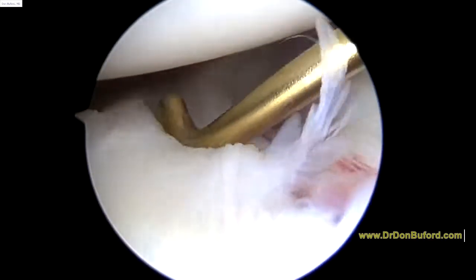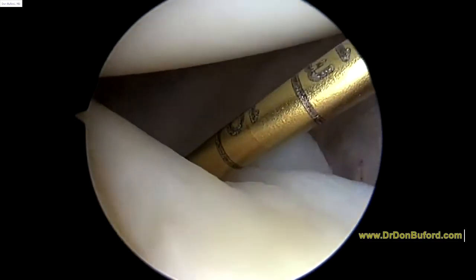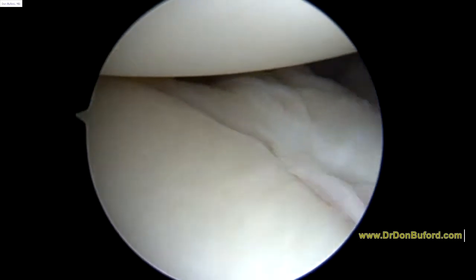Okay? This little thickening right here. And again, that probe is 1 millimeter. So that's it. This looks pretty good. We're going to get to work and look on the bursal side in just a minute.